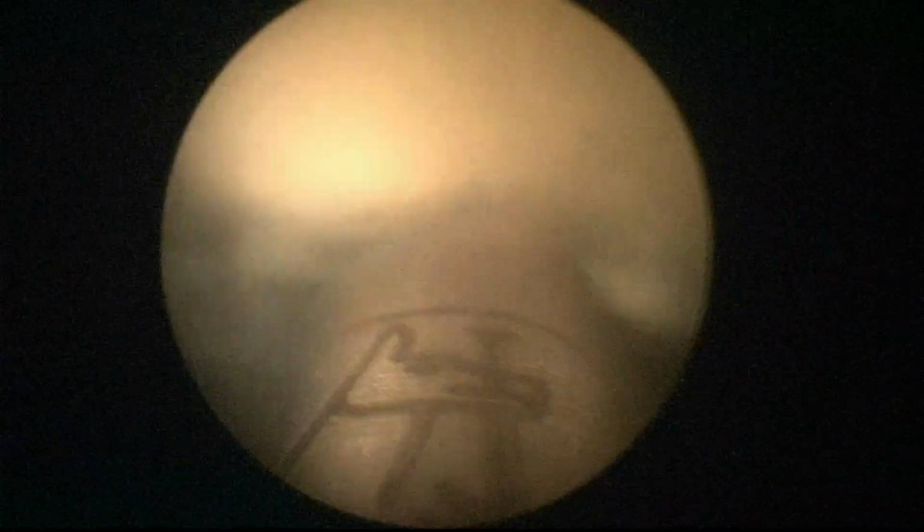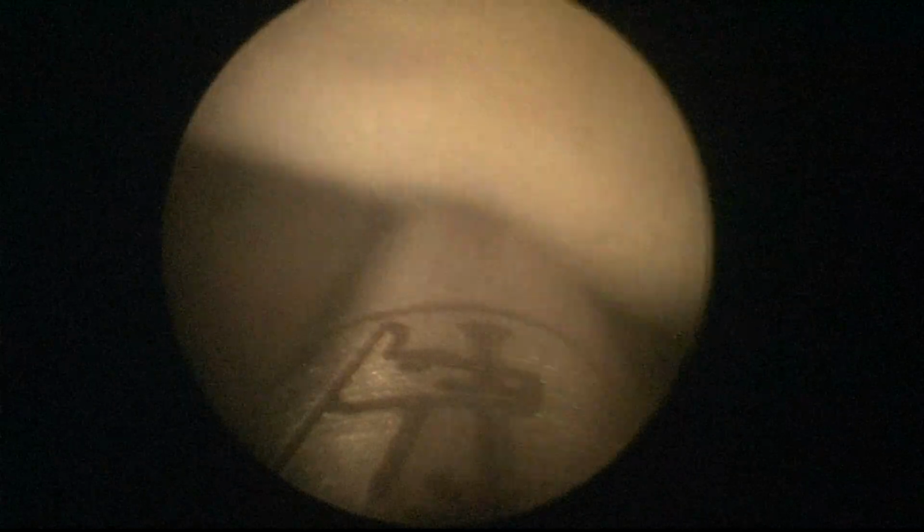As I like to say, with HoLEP you have to be present in the operating room. You cannot keep working and forget about what you're doing. You cannot go to the automatic mode. This was very common with green light vaporization. It was slightly boring to have to vaporize larger glands, and you could get bored. And I developed this idea to be present, to check every second what's going on.